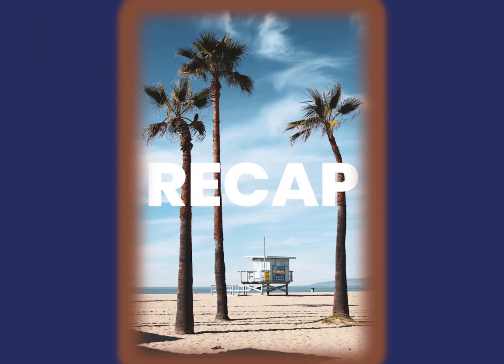So at the end of it all, end-tidal is a very diverse tool for monitoring our patients, from spontaneously breathing to patients who are in respiratory or cardiac arrest. It's a rapid, continuous metering of patients' perfusion, helps us determine patients' response to treatments, and it ensures that we are ventilating efficiently. It also provides us with prognostic indicators, such as in patients with hypoglycemia, hyperglycemia, and in septic shock. Get used to using the end-tidal CO2 on a regular basis.